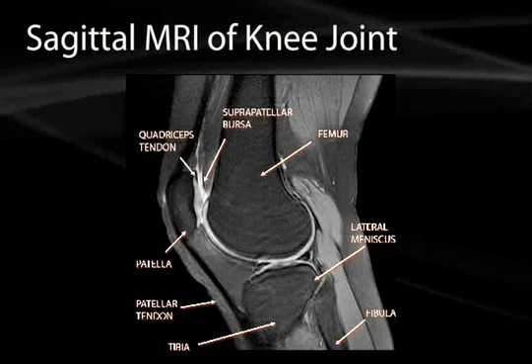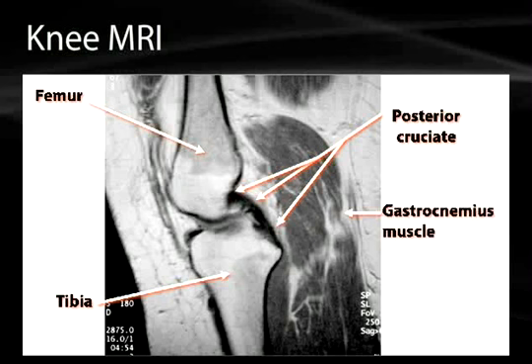Several structures to be aware of: this view shows nicely the lateral meniscus with its anterior and posterior portions. You may see gaps or tears in tendons on MRI. Off the patella, you can see the patellar tendon coming down to the tibial tuberosity — look for fluid accumulations, which will show up whiter, such as in this suprapatellar bursa that has a little bit of fluid in it.